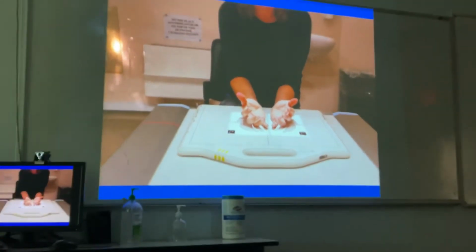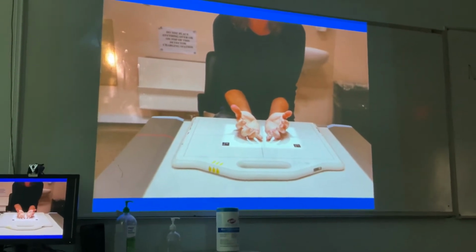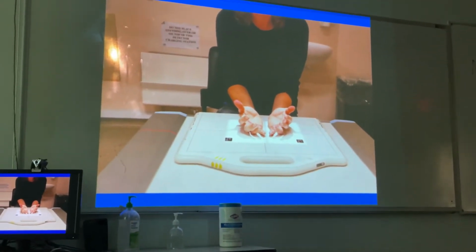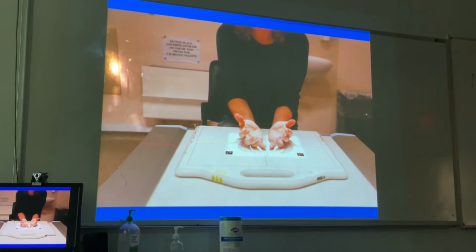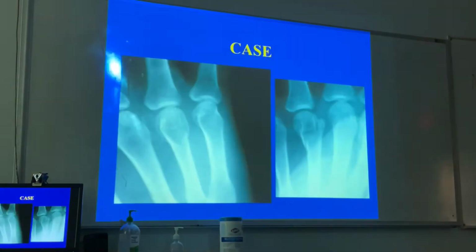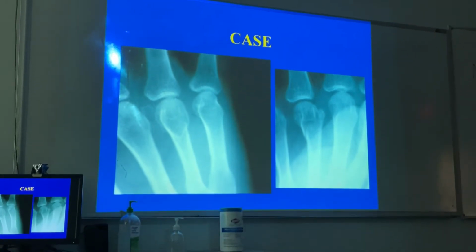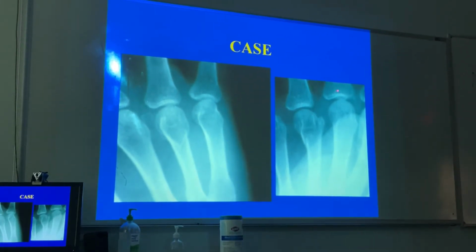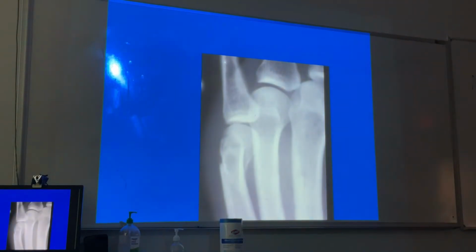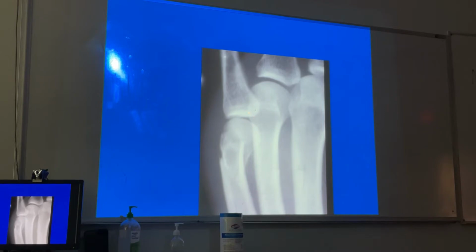That's why it's done bilaterally and symmetrically, but also if you're worried about subtle trauma. Now, we said subtle trauma is best evaluated the smaller the joint, the more views you have at it. So I'd rather you do PA, oblique, and lateral view of the wrist. You're going to find more things than if you do PA and just lateral. So normal, that's pretty obvious when you compare side to side. There's deformity. This is what the normal metacarpal head should look like.